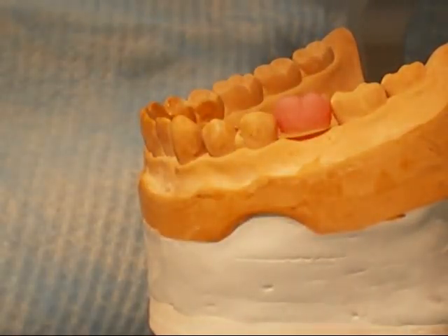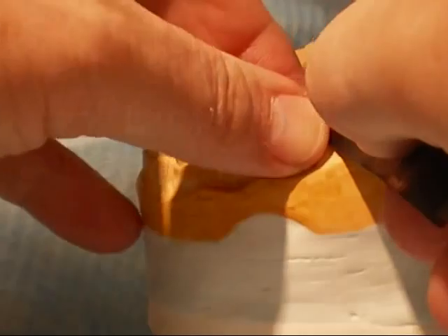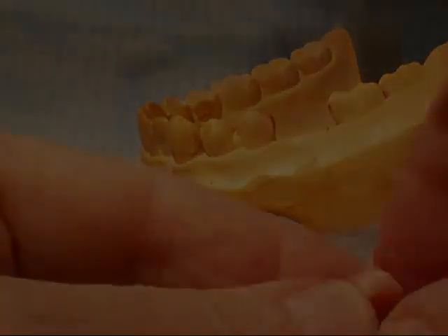Place the tooth on the cast. Mark the proximal contacts and adjust by grinding if necessary. Bring the tooth into occlusion. The replacement tooth is touching its antagonist and the centric pin is closed.